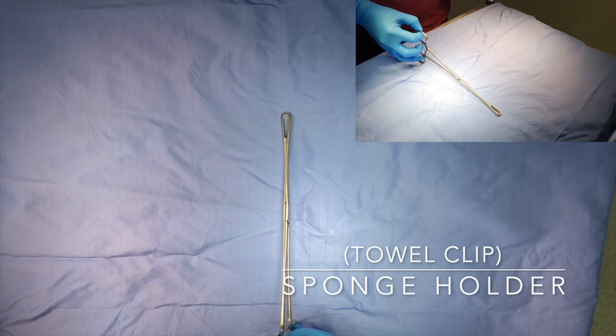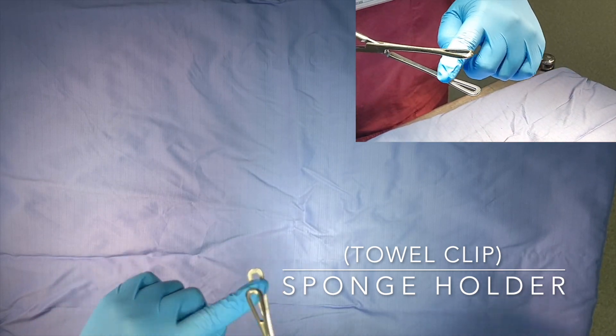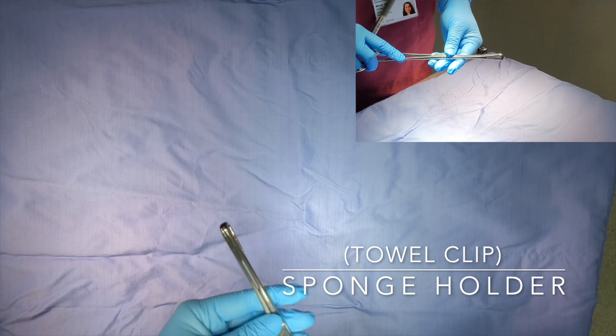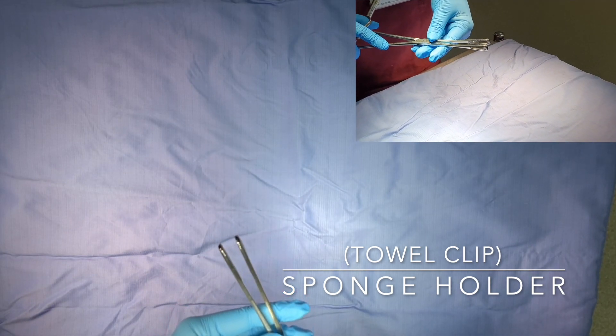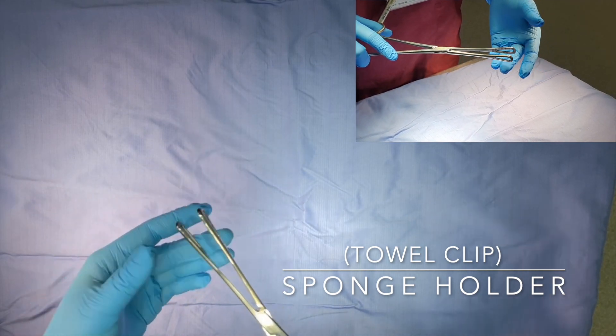This is a Rambley sponge holder, used for holding swabs when preparing the skin at the start of an operation. It has wide-set jaws to keep the swabs in place as the antiseptic solution is applied thoroughly to the skin. You will usually use about two to three of these before starting the operation.